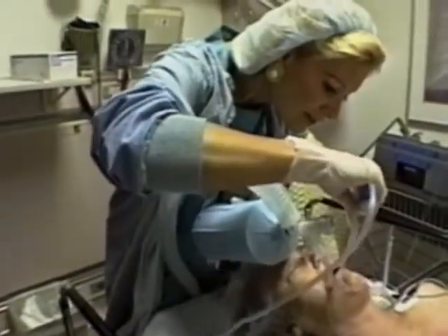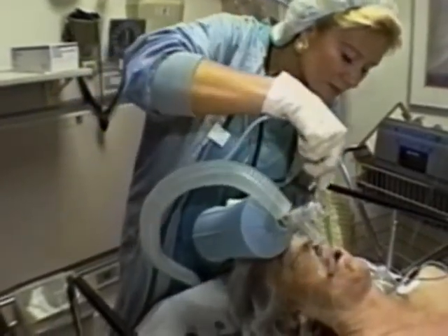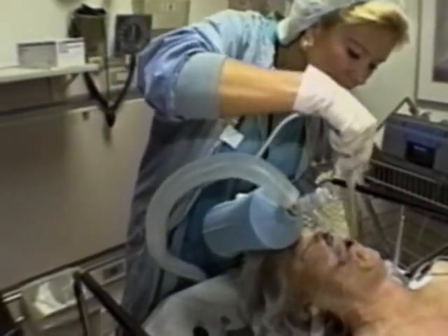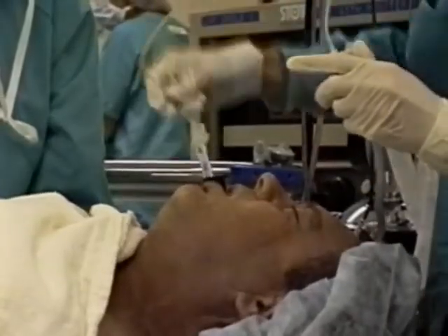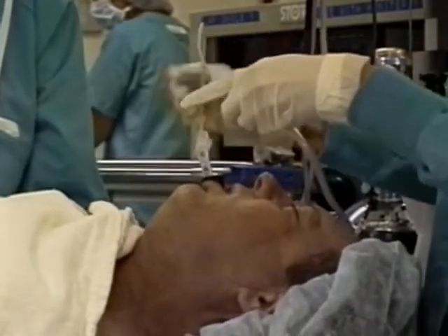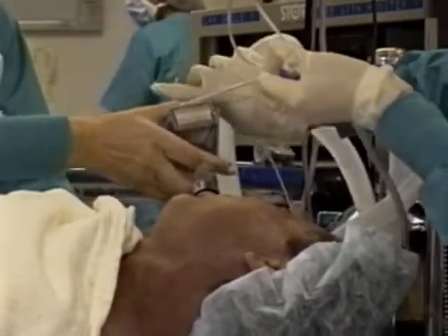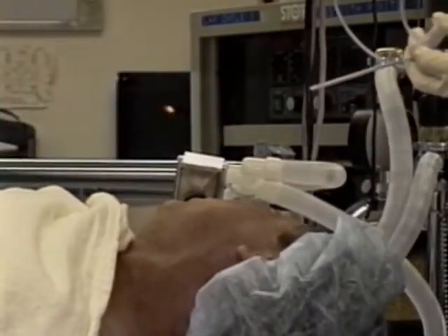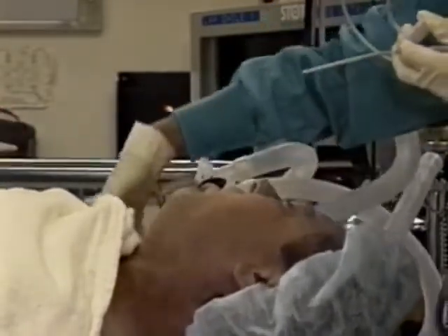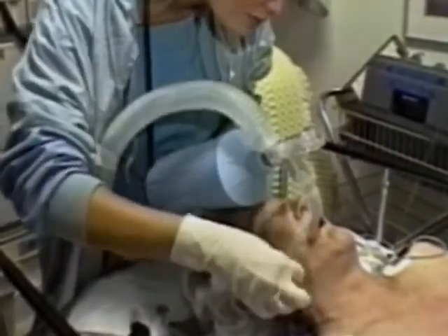Suction the pharynx well prior to extubation. Leave the cuff inflated until you're about to remove it to prevent oral secretions from draining into the trachea around the tube. If you need to suction secretions out of the endotracheal tube itself, oxygenate the patient well beforehand. To avoid hypoxia, limit the time spent suctioning to less than 10 seconds. Make multiple passes if necessary and oxygenate the patient between each pass. After suctioning and oxygenating, untape the tube.